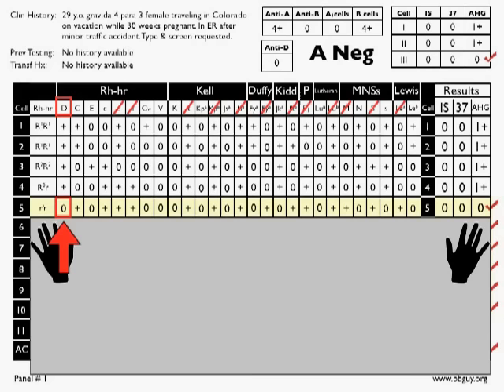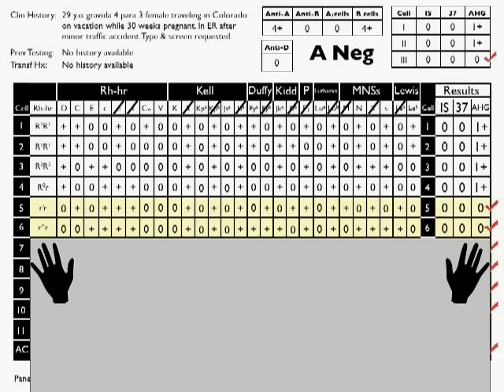Okay, so we've done the first row. The rest of them will go faster, I promise. We slide the paper down to cell 6. And again, let's go the same way. I've changed the color of the slashes at the top, not because that's anything necessarily important, but just because I want to show you when I'm putting a new slash in. You don't have to break out a 15 colored pen to do these panels.